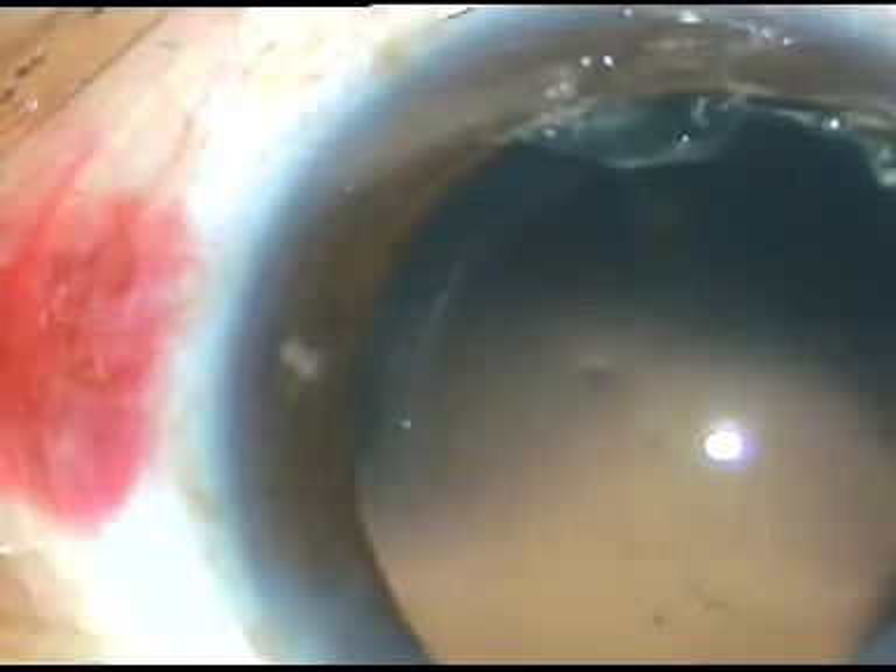Some fibrous tissue kind of thing is sticking to the posterior capsule. The patient is young, 35 years old. Anyway, he is going to need Nd:YAG laser capsulotomy in the coming 3–4 months. So I need not use a lot of polishing.